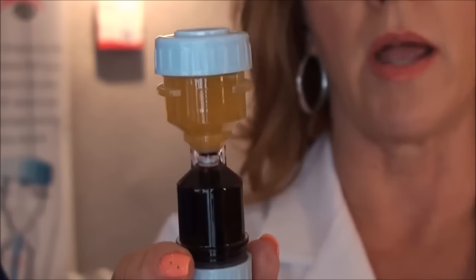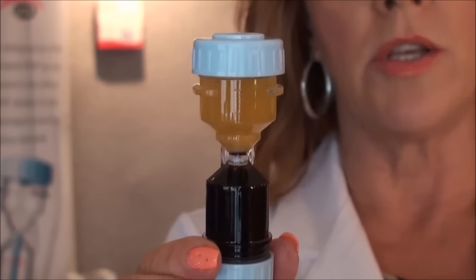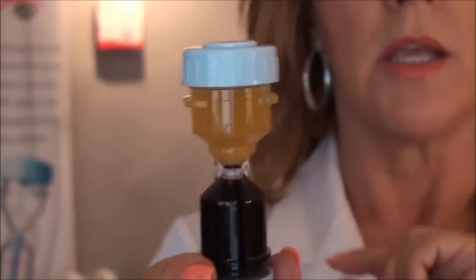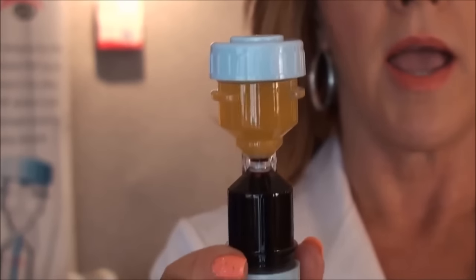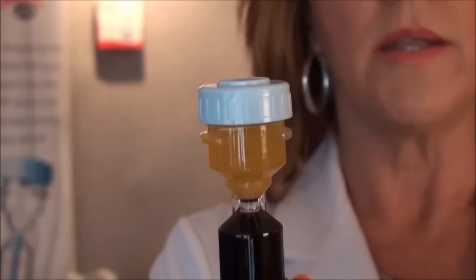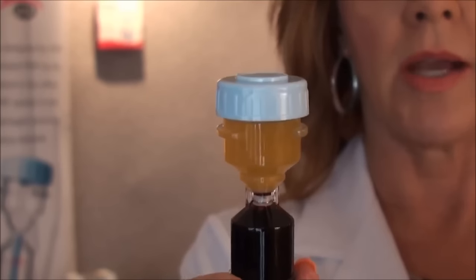So if you are going to inject a face, you would just simply shake this and withdraw the product into 1cc syringes. It's ready to inject.